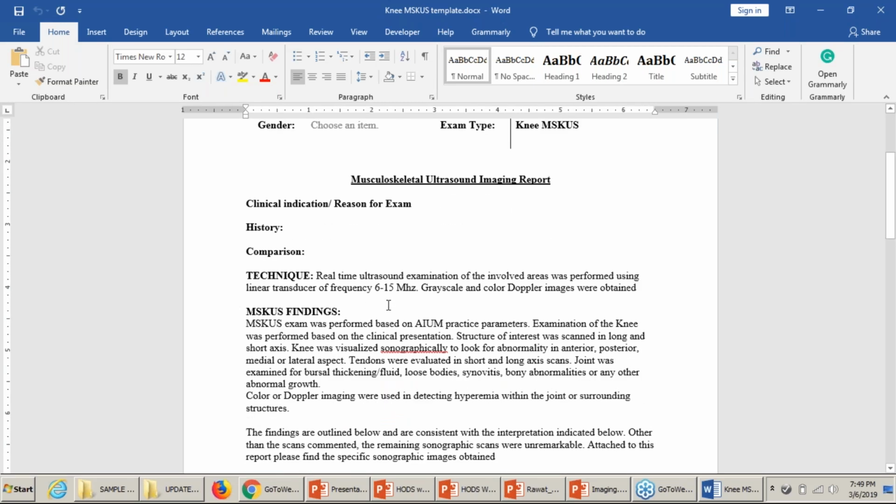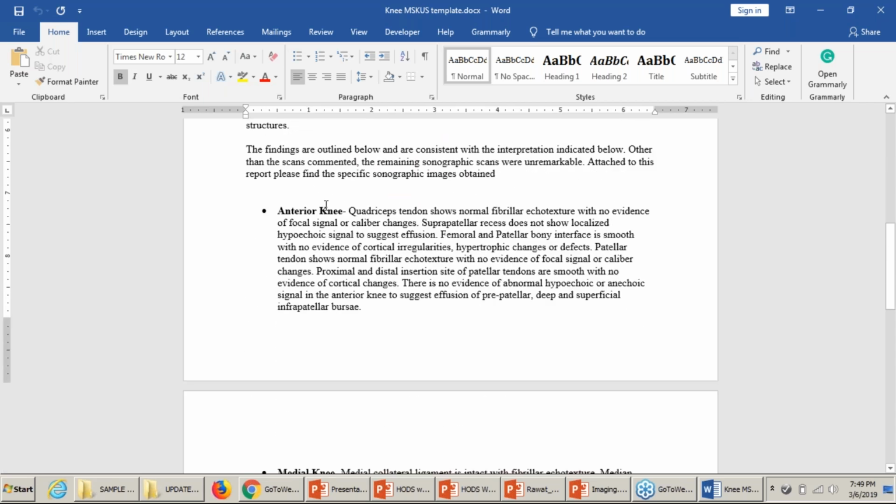So every time you write a report, you want to go over these findings and make sure that you don't have anything that you're not testing, and that you're not missing something that you tested and did not mention here. Yeah, I think it's very helpful. If you did something more than what I have here, or something not mentioned here, and that structure was not abnormal, you don't have to write that under impression, but you should mention in the findings that that structure was normal.